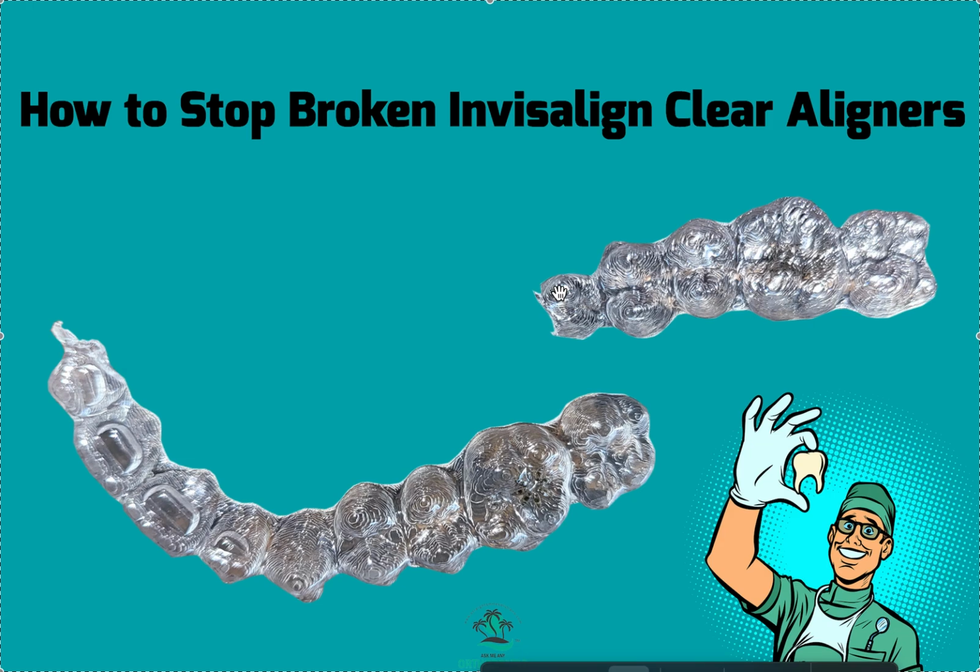Other thing is the material is slightly more elastomeric, slightly more flexible. I don't know, brittle stuff might break more, but it's also thinner. The trim is lower, so that makes it easier for it to break and snap. Ultimately, that shouldn't be happening unless you have an undercut, or if your aligner is not tracking very well, it can be rocking, and that can make it get a weak point and snap.